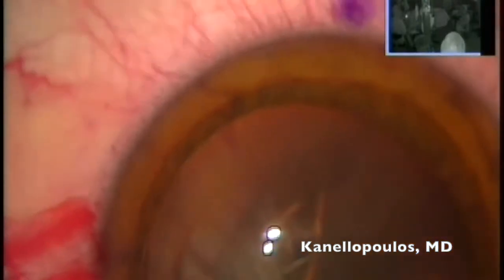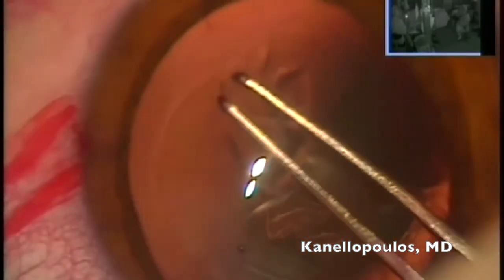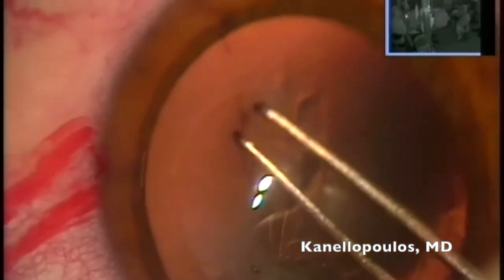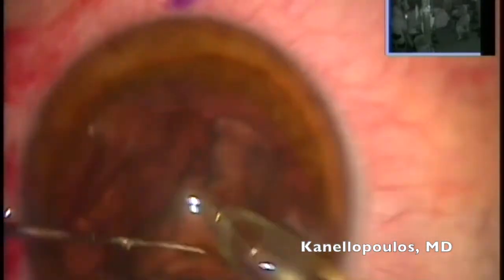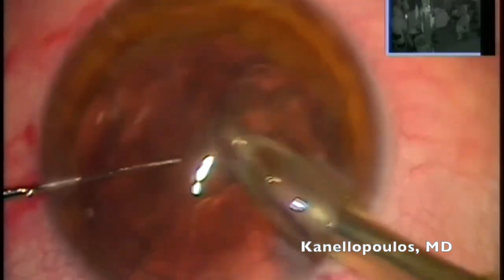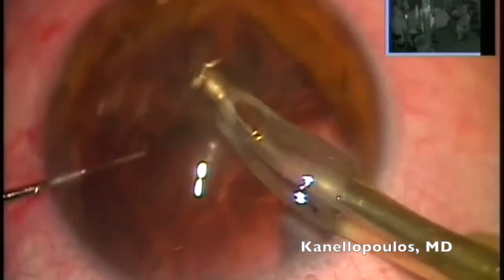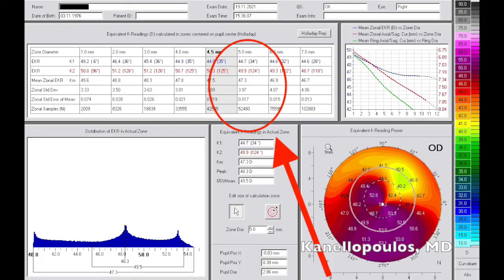This is a continuous curvilinear capsulorhexis with the Utrata forceps. We make sure it's just under 6 millimeters, which is the optic size for our Acrysof Toric Aspheric IOL. The lens is relatively easy to remove with minimal phaco energy. After irrigation and aspiration is completed, the procedure is done. But during my procedure, we are recalculating the lens based on the 5-millimeter Pentacam data.